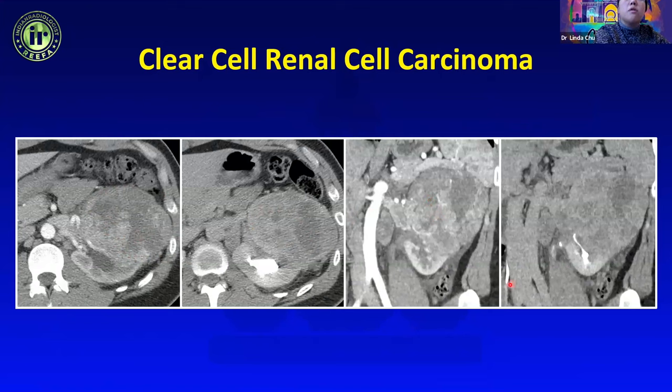Renal medullary carcinoma is an aggressive renal malignancy in young patients with sickle cell trait. It is usually a centrally located, infiltrative mass that can show renal vascular invasion, and we typically see retroperitoneal lymphadenopathy or even metastatic disease at the time of diagnosis. This example shows a very infiltrative growth pattern centered more centrally in the kidney with liver metastases and extensive lymphadenopathy at diagnosis — a very aggressive-looking lesion, classic for this population.